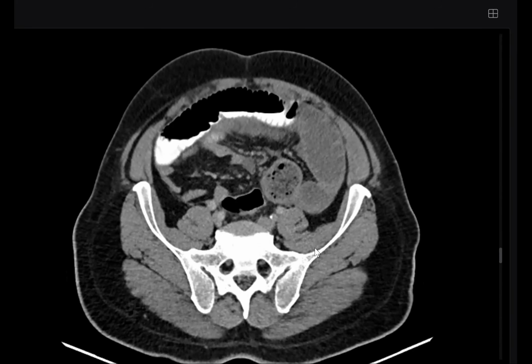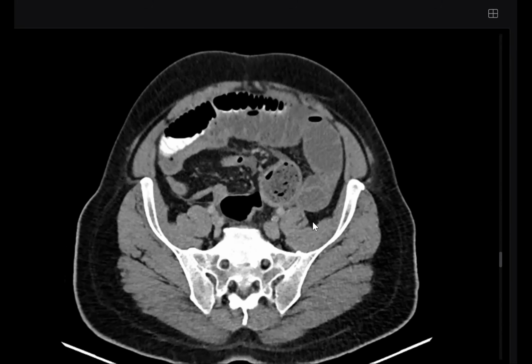So sir, this can now be assessed in other planes like sagittal or coronal. In my routine practice, I will check for them because desmoplastic reaction can be seen better in other planes. Good. What else you should look for in this case?